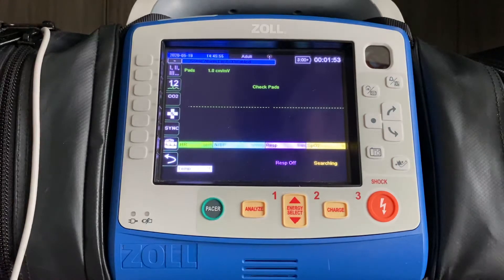The perfusion index is going to tell the provider whether or not the finger they have chosen to put the finger probe on is perfusing properly, and make them aware of whether or not the other values on the screen that they see are legitimate or not.